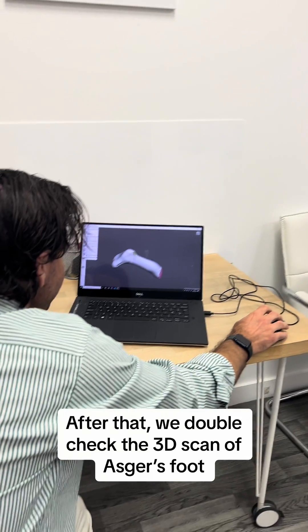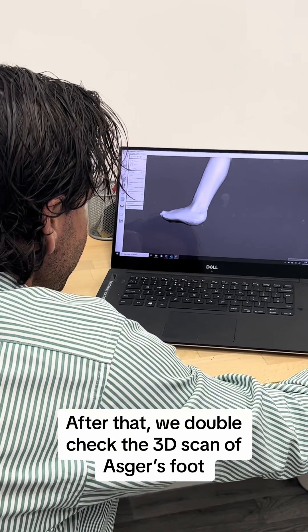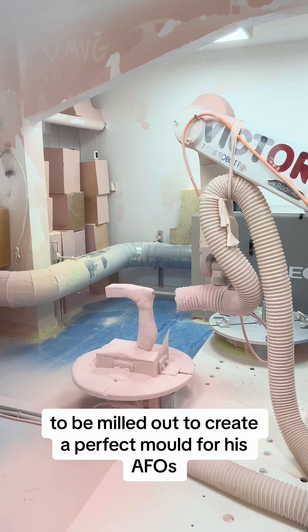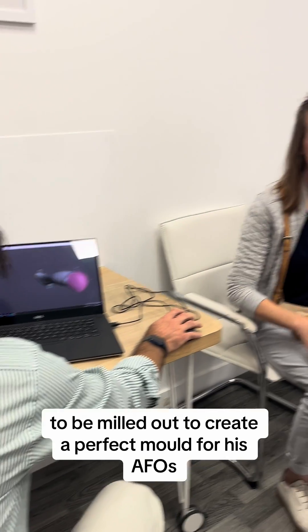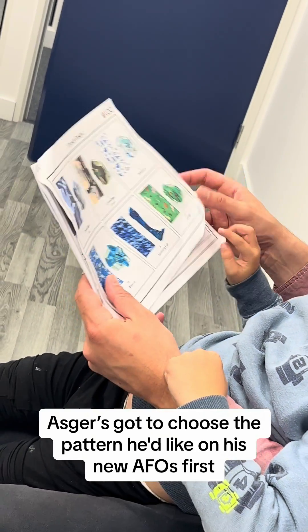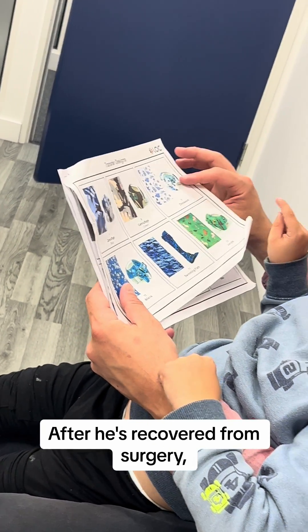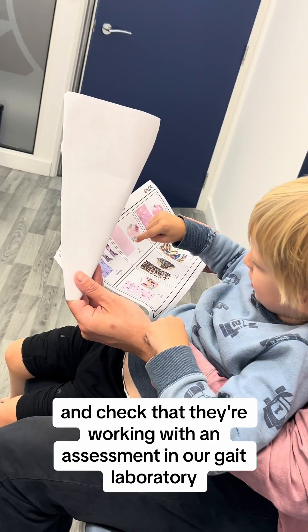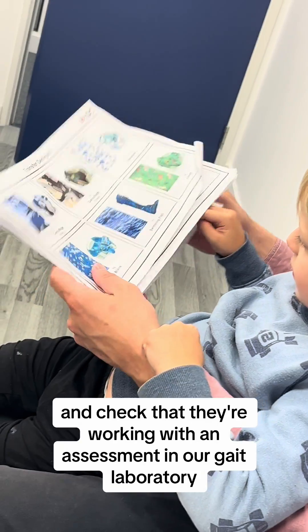After that, we double check the 3D scan of Asger's foot before sending it to our in-house manufacturing workshop to be milled out to create a perfect mould for his AFOs. But before he goes, Asger gets to choose the pattern he'd like on his new AFOs. After he's recovered from surgery, we'll be following up with Asger to fit his new AFOs and check that they're working with an assessment in our gait laboratory.